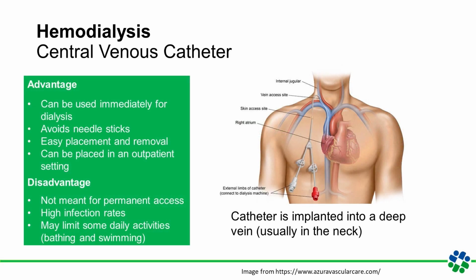Central venous catheter, or CVC, is one of the methods we use to access the bloodstream for hemodialysis. Its significant advantage is immediate usability. If dialysis is needed urgently, a CVC often becomes the preferred choice. It's also beneficial in that it avoids repeated needle sticks, it can be easily placed and removed, and is usually implanted in an outpatient setting, allowing you to return home the same day.